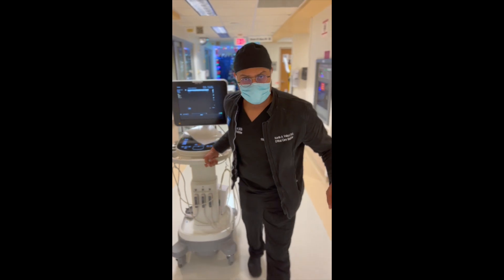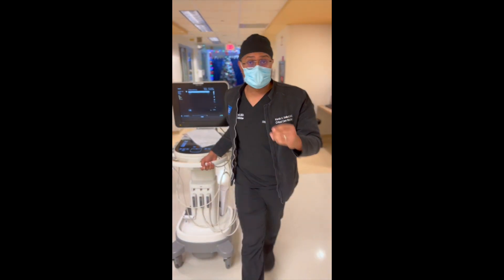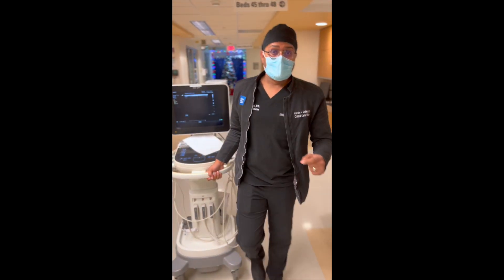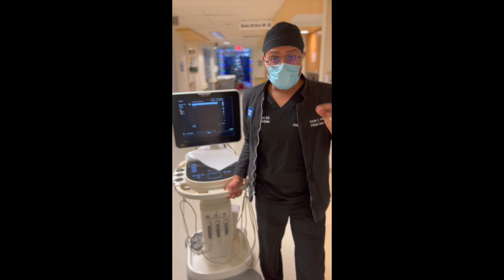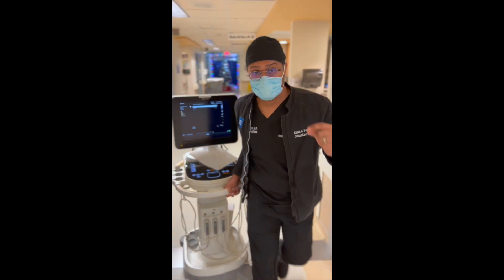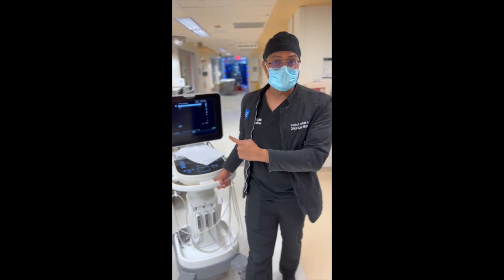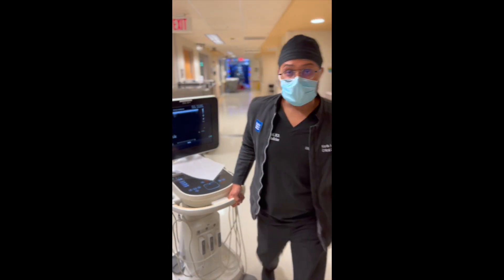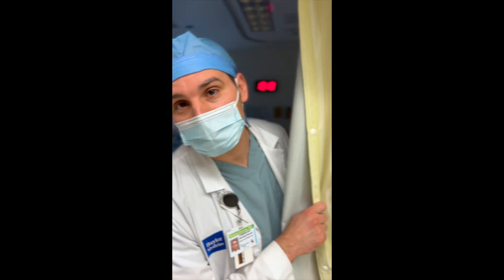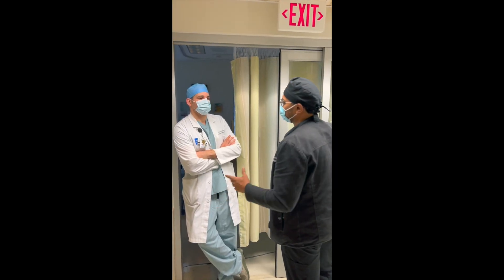In critical care medicine, the most important thing is placing lines, and the way we place lines is important to understand with ultrasound guidance. I have a few questions for Murat. Hey Murat, how do I confirm the vascular structures on ultrasound?